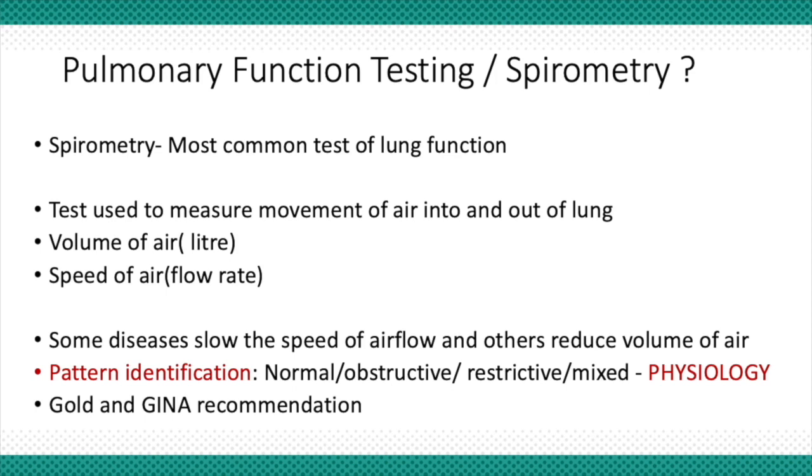Since guidelines have started accepting spirometry as a part of diagnostic criteria and to meet diagnostic eligibility, a lot of times spirometric interpretation has drifted towards diagnosing a particular abnormality, mostly obstructive versus restrictive, asthma versus COPD, and so forth.